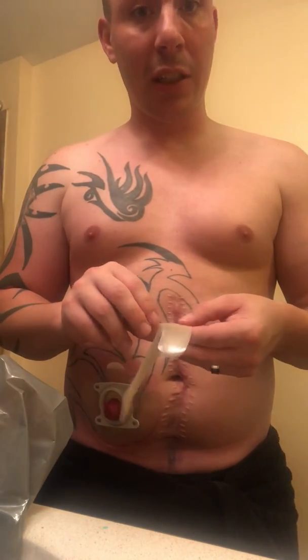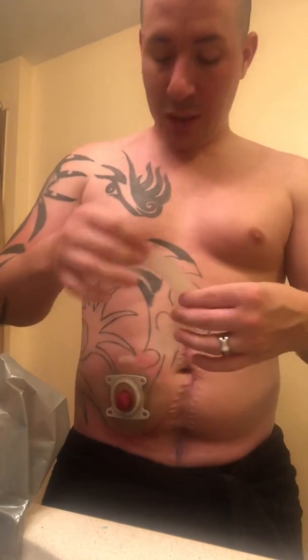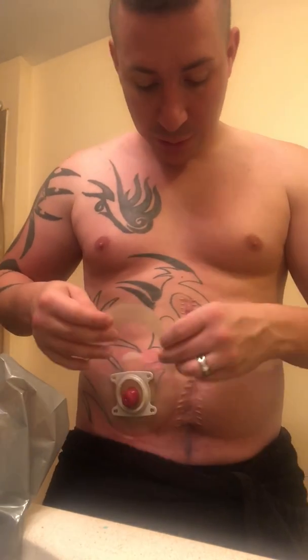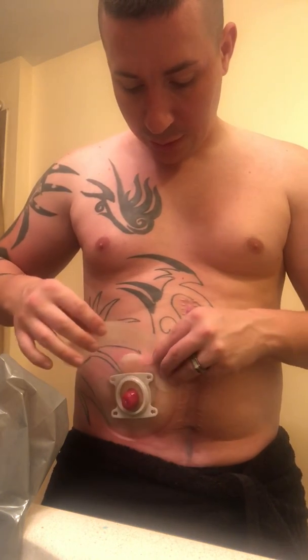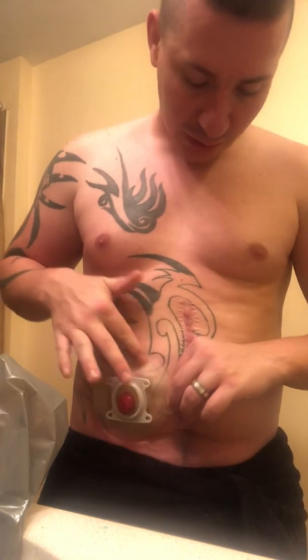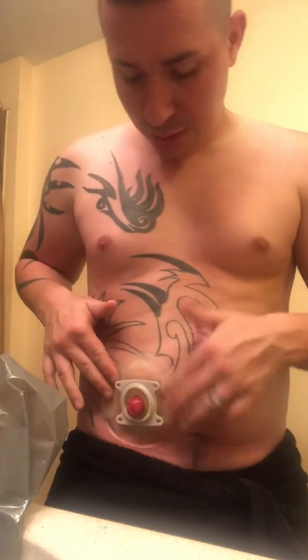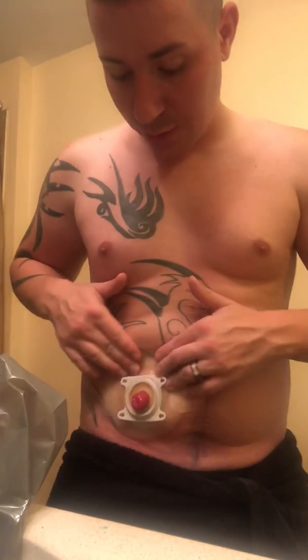I was not very good at changing my bag at first. My wife had to do it. I was not very comfortable doing it at first. But 10 months in, and I pretty much change it on my own every time, unless I need a little help. Because the key is change it later in the evening or first thing in the morning when you have nothing in your system, so your stoma is not active.